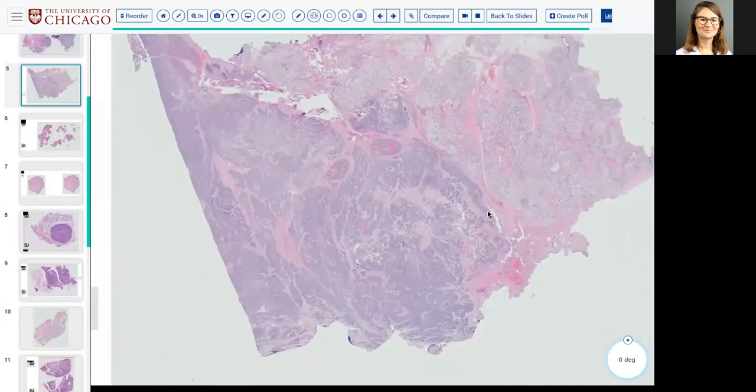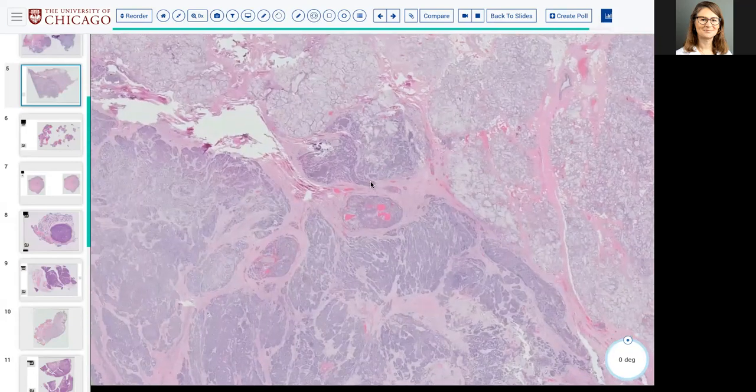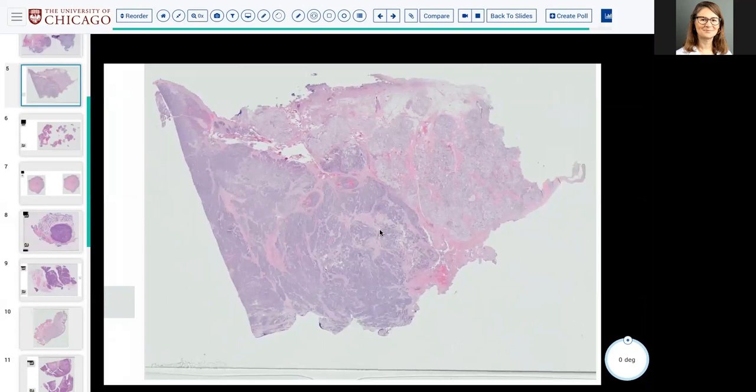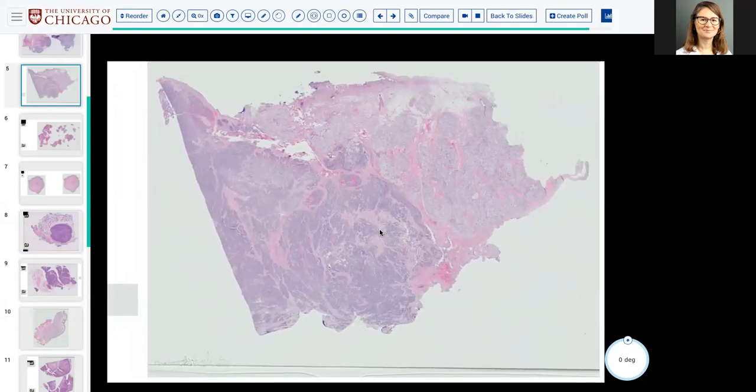There's no great clean grading system that spans salivary tumors, but the things I like to always keep in mind are necrosis, always bad; increased mitoses, generally bad; PNI and LVI, also generally bad. The one exception is polymorphous low grade, which can have PNI and still be low grade. That's one of the exceptions to the rule, but otherwise those features, necrosis, mitoses, PNI, LVI, would generally put something in a higher grade category.